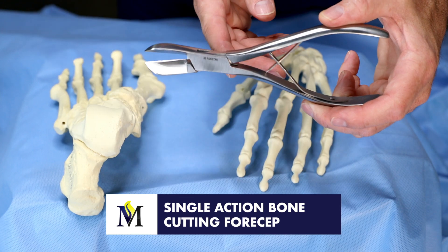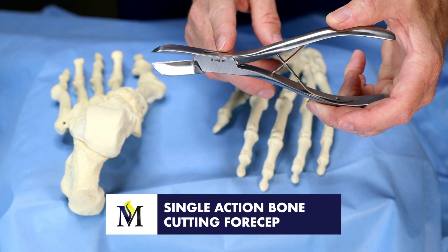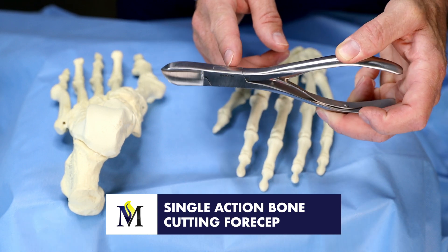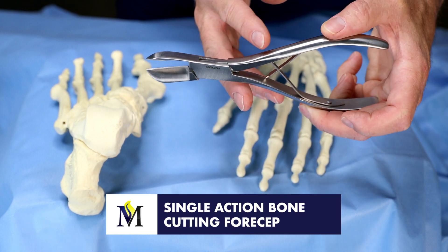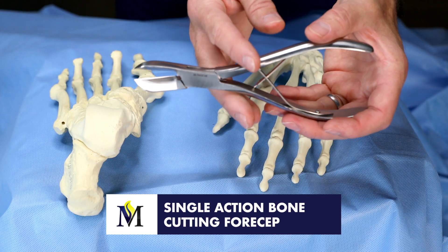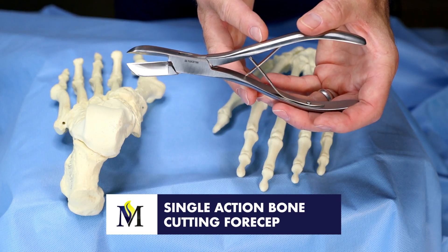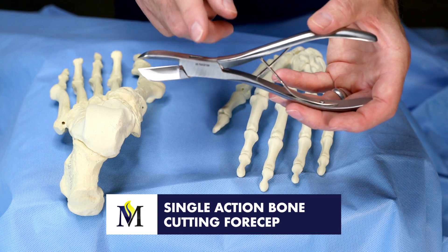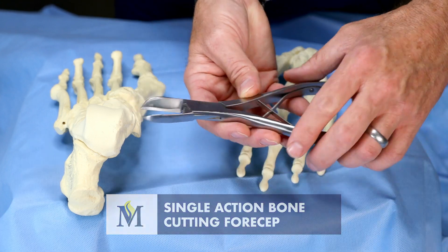We have double action bone cutting forceps and rongeurs that will have a gap in the middle that will spread out and provide much more aggressive cutting action — the double action. But this is a single action bone cutting forceps.